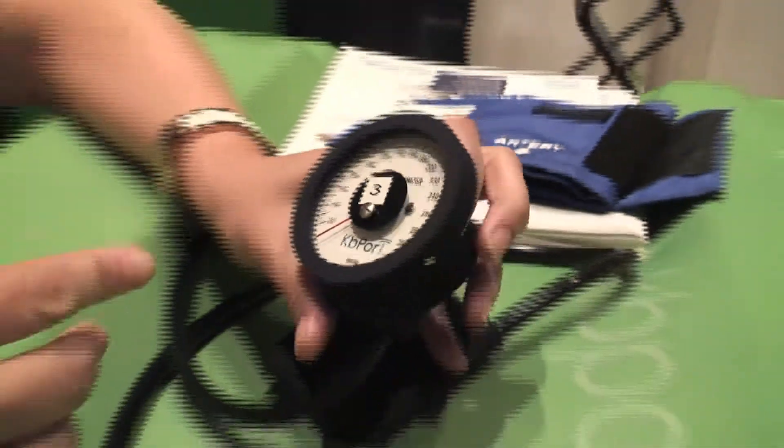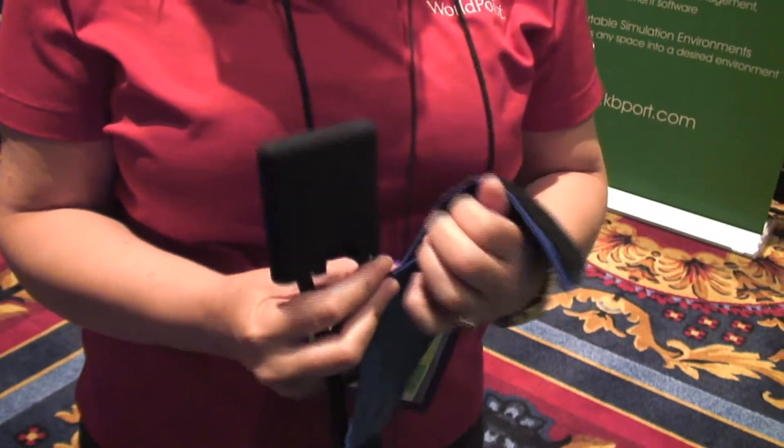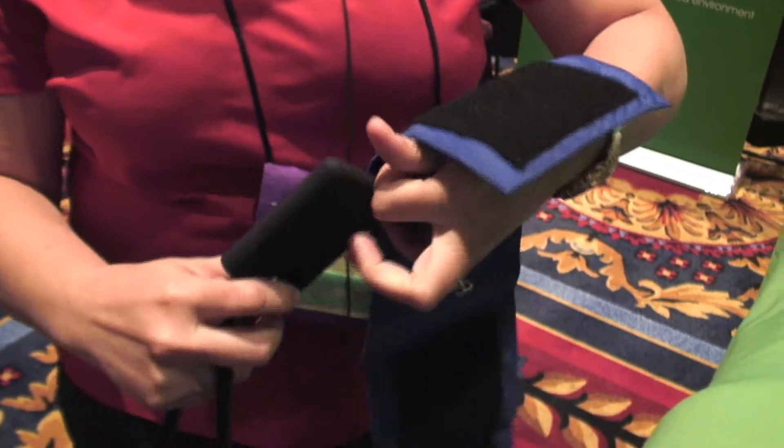It is the only simulator on the market that actually gives you both visual feedback and audio feedback, so you can specifically test your students on what they're seeing compared to what they're hearing. This piece here is interchangeable between various sized cuffs — you slide it into the stethoscope or into the blood pressure cuff.